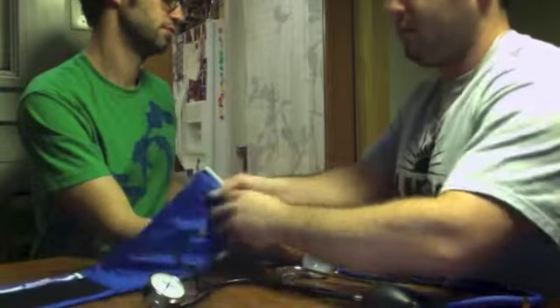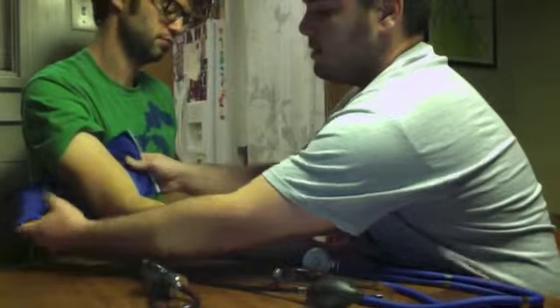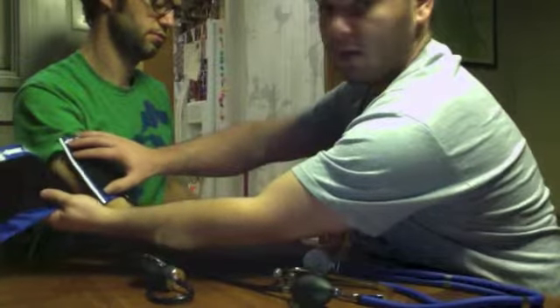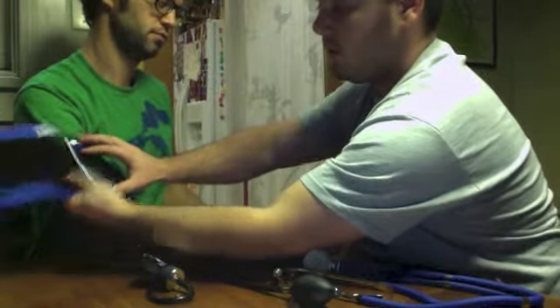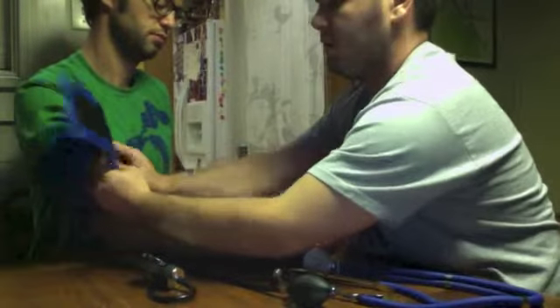So what we're going to do is take the blood pressure cuff and put it right above the cubital area of his arm. And we're going to check to see if he's in that okay range for the adult. And he looks like he is in that range.